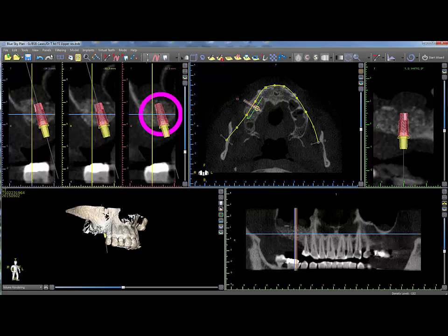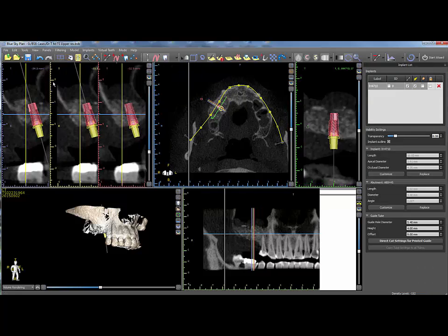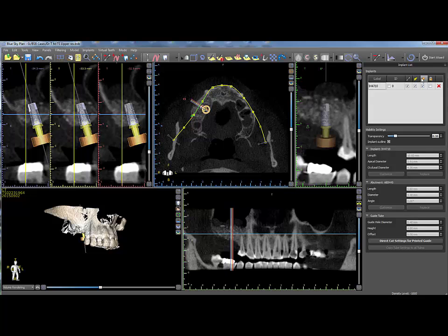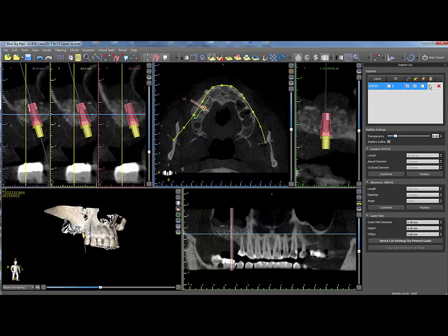To control implant and implant related objects, open the implant panel by going to Panels, then Implant List. The visibility of the objects can be toggled on or off by clicking either the object image or the specific checkbox for implants, abutments, and guide tubes. To lock implants, click on the lock icon or the individual checkbox for the specific implant. The ID box is clicked to toggle the implant ID number on or off in the 2D and 3D views. The implant ID can be edited by double clicking on the number in the ID box and keying in the desired alphanumeric character.